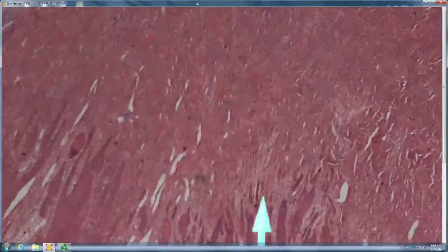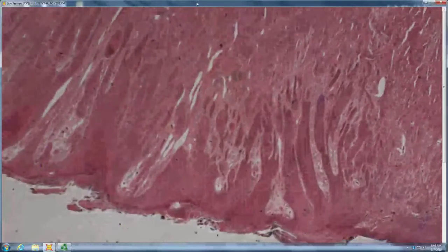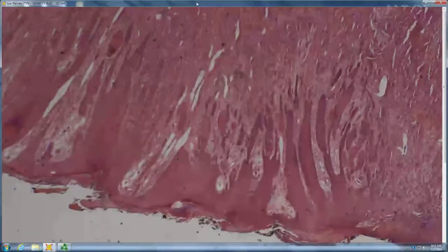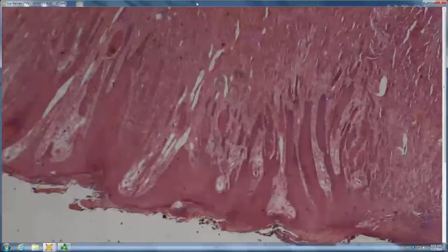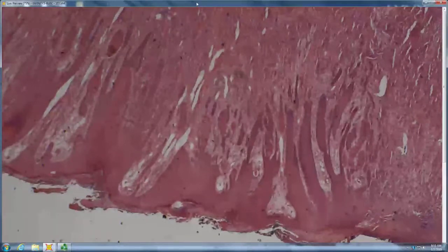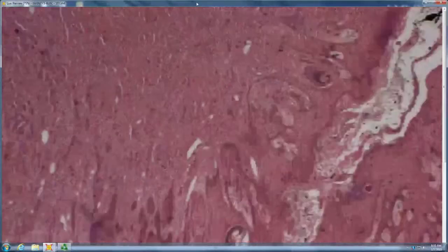So, what do you think? Tell me about the epidermis. Yeah. So GCT, there's massive pseudoepitheliomatous hyperplasia over it, right? Very easy to have that misread as invasive squamous cell carcinoma.